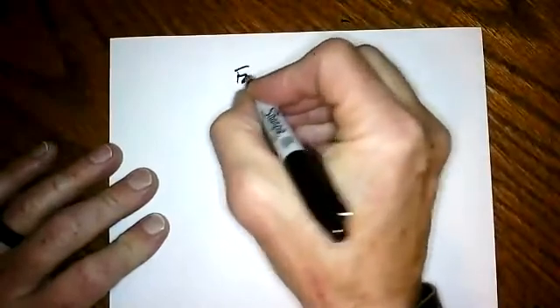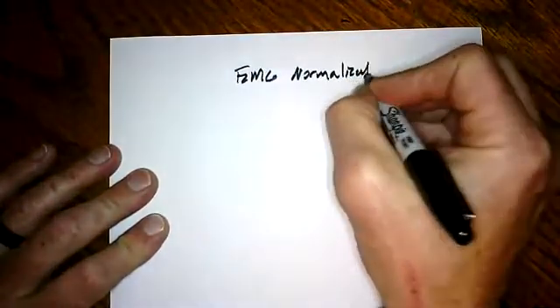We just add in EMG normalization. To normalize, you need some level of activity of the muscle to call 100%. And this is tricky, okay? Now, we're used to normalizing data in ground reaction forces. We normalize to body weight because we know what body weight is, that's predictable. And if we measure body weight today, we can measure body weight tomorrow, the next day. And it's a fairly easy number to get. Now, it's not necessarily consistent day to day, but hopefully you know what I mean, in that it is a number that if you stand on our scale, you stand still, we can reliably and validly measure how much you weigh.